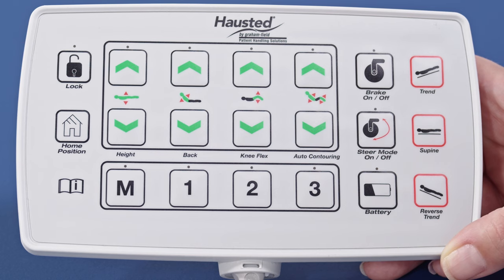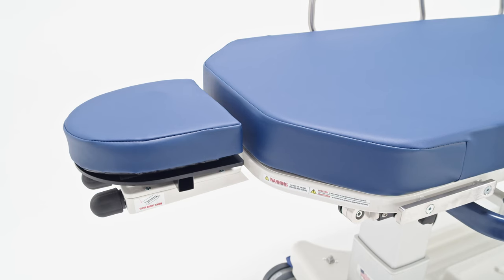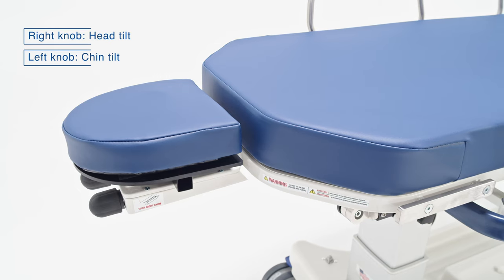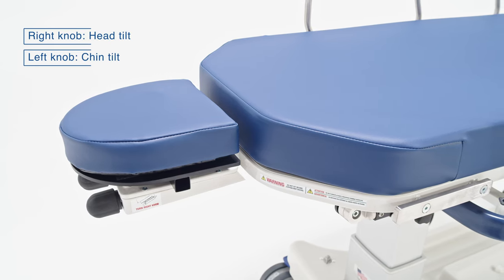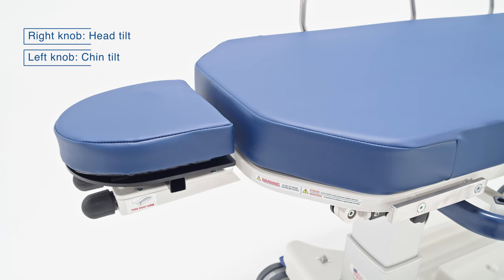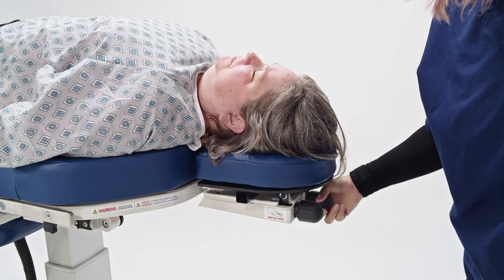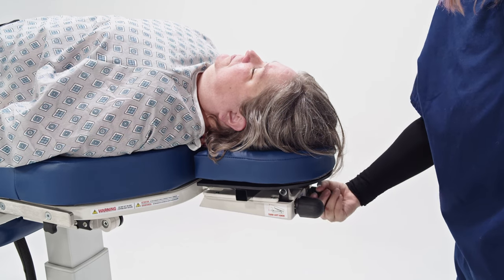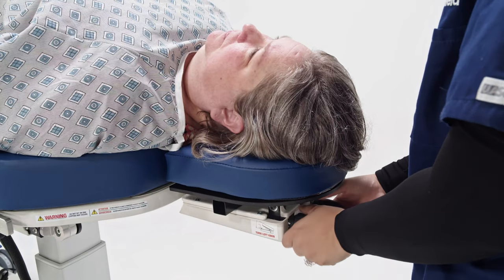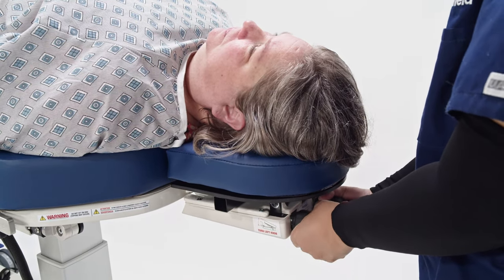Our patented articulating headrest on the 5E82 stretchers offers smooth, infinite positioning of the head and neck without sacrificing valuable surgeon leg clearance. After understanding which knob creates which action, quick and smooth infinite adjustment can be achieved by rotating the selected knob to the desired position.